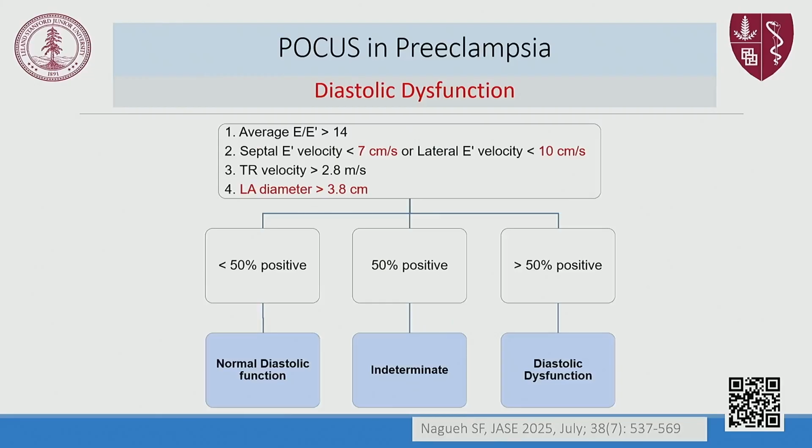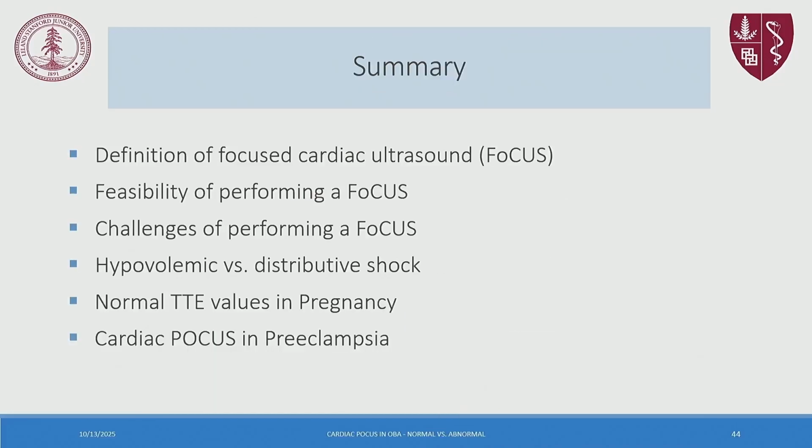And here, as a last slide, I also looked up the normal values for diagnosing diastolic dysfunction. I know that goes above focused cardiac ultrasound, but these are the pregnancy-adapted values for how to diagnose diastolic dysfunction in preeclamptic patients. Thank you very much. I hope I was able to give you a brief definition of focused cardiac ultrasound. Thank you.